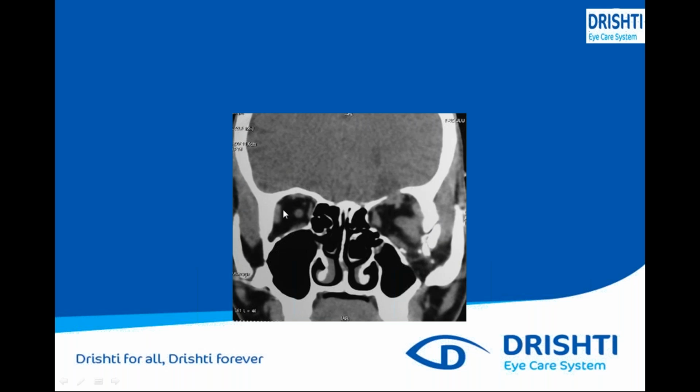If you compare the rectus muscles over here, this is the regular size of the rectus muscles. This can be measured. But here you can see, due to the fractures, these muscles are also swollen. If you clinically see, there should be pain while opening the mouth. There might be temporary swelling near your ear, the temporal side, and the extraocular movement will also be restricted in this case. So always your report has to be matched with your clinical evaluation.